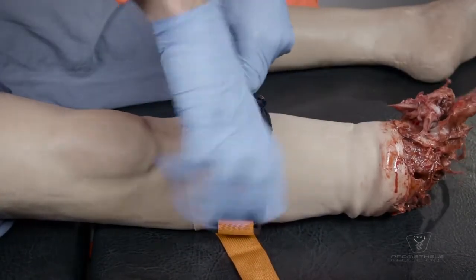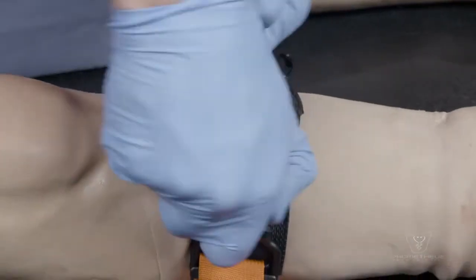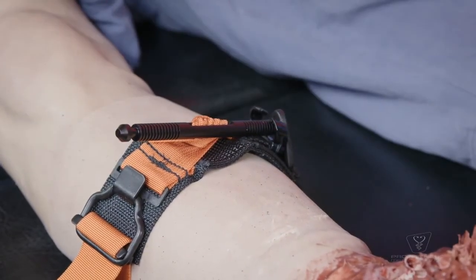Twist the windlass until the main flow of bleeding is significantly reduced or stops. Be aware that the patient may find this painful. Slip the end of the windlass into the plastic triangle to lock it into place.